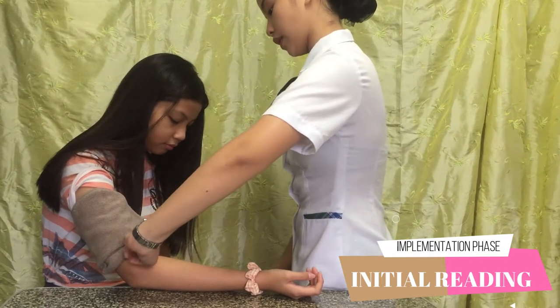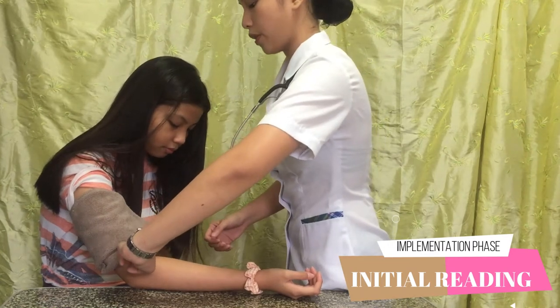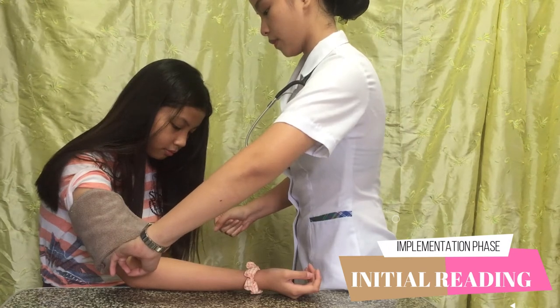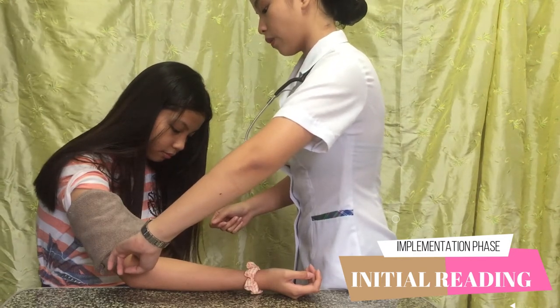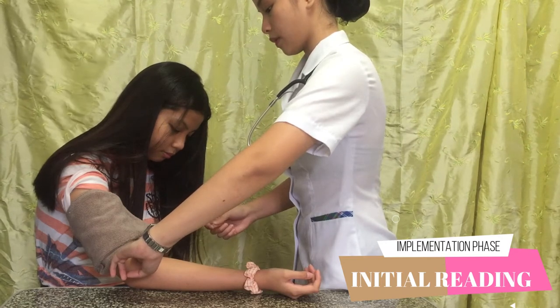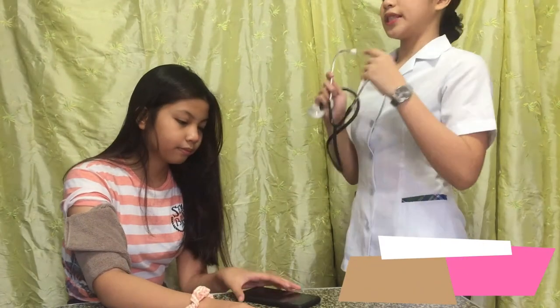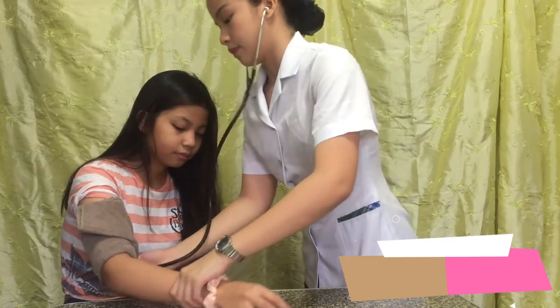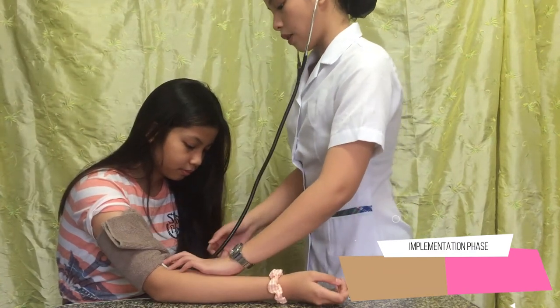At this moment you should auscultate the brachial pulse — which I forgot to use the stethoscope. So we don't feel the pulse at 200 mmHg and then we are going to deflate. Now we are going to proceed to use the stethoscope and we are going to place it in the same area. So we listen to it again, and we are going to inflate.